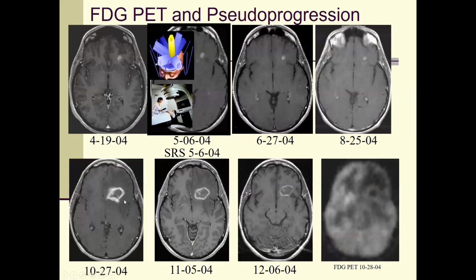So this is one phenomenon we really have to be aware of, to not mistake this for progression of the disease.